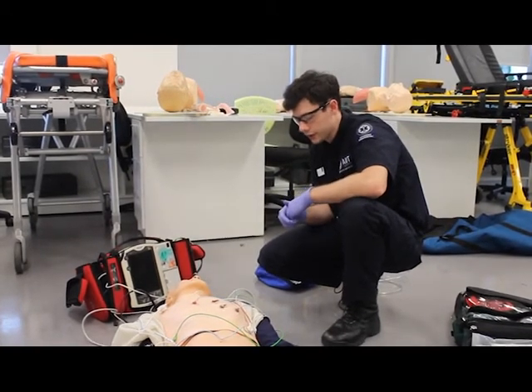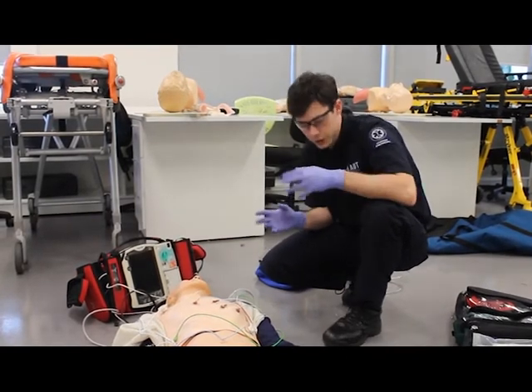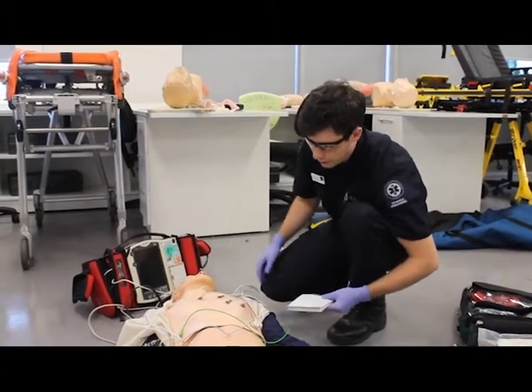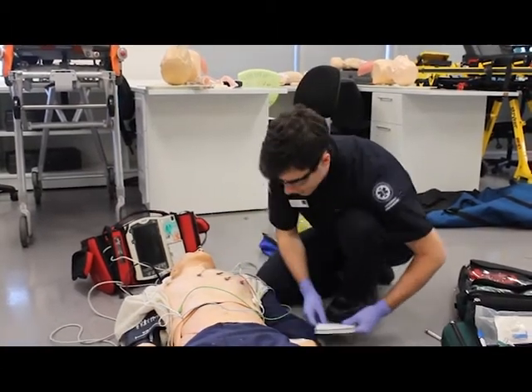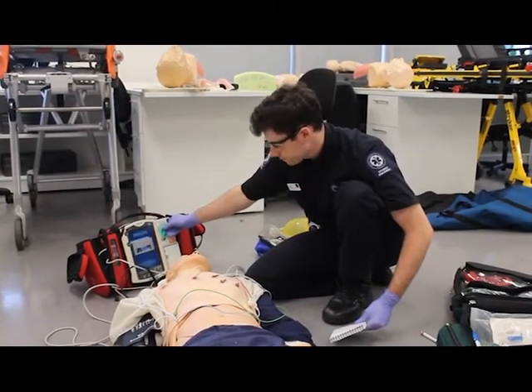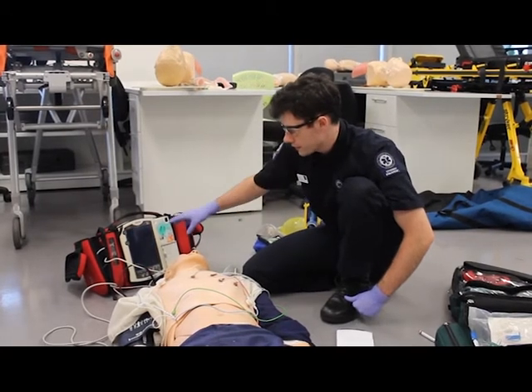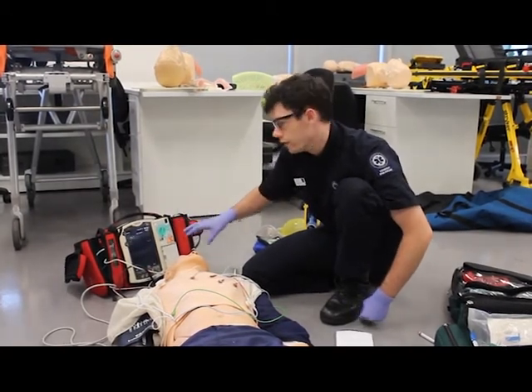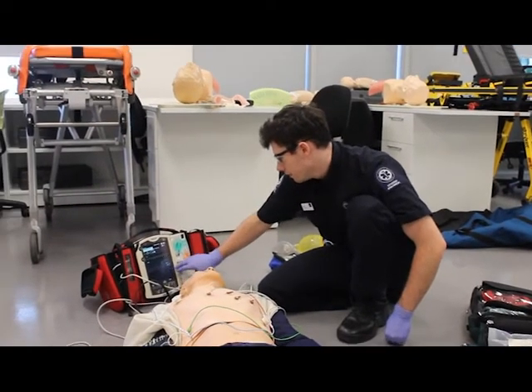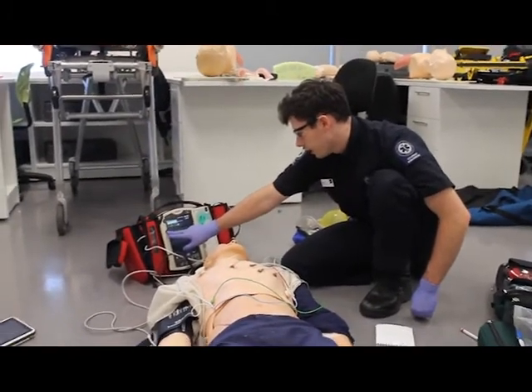Now that we've decided we're going to cardiovert Bob, we're going to go through our cardioversion checklist, which we've got right here, where we attach our defibrillator pads, done right here. Turn our monitor to manual mode. We're going to now select a lead on the monitor with the largest visible R wave. I'm going to pick lead 2 because it's got the largest visible R wave.